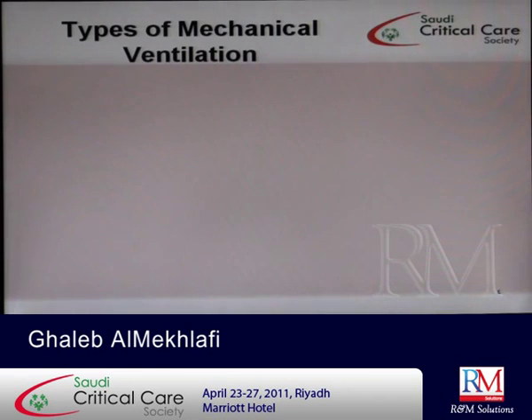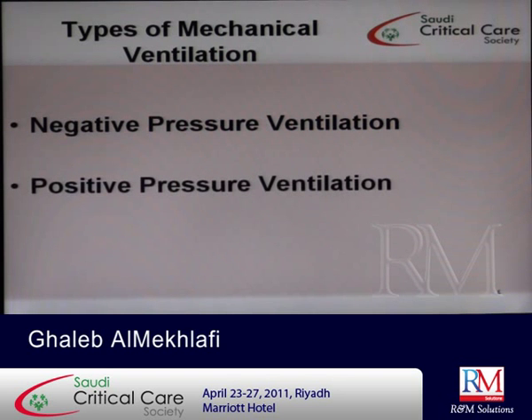So, what are the types of mechanical ventilation? In terms of technique, there are two types, either negative pressure ventilation or positive pressure ventilation. And the positive pressure ventilation is either non-invasive or invasive. What we mean by non-invasive and invasive: invasive is that if there is an artificial airway. So if there is an endotracheal tube or tracheostomy tube, this is called invasive positive pressure ventilation.